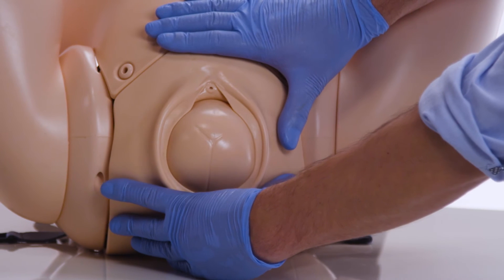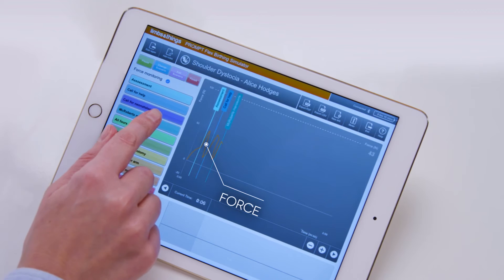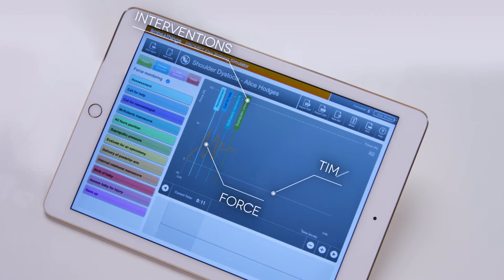The three main parameters measured through the software during training are force applied to the baby's head, interventions made during delivery, and time taken to deliver the baby.